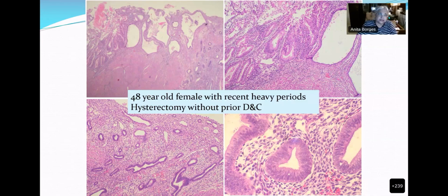That's all you see. Can anybody help Mansi? I can see three things. Can anybody else see three things? Mansi, can you see three different areas? I can see the stratum basalis, which is present, and muscular layers, the myometrium, can also be seen. Yes, of course, there's a muscle, and you can see that. Let me take another color.